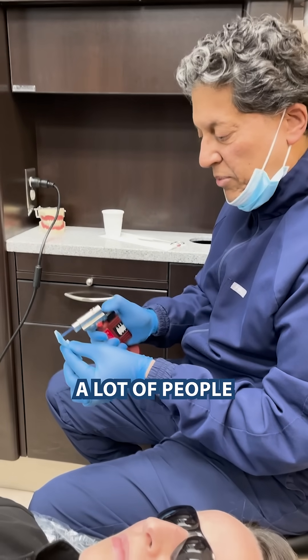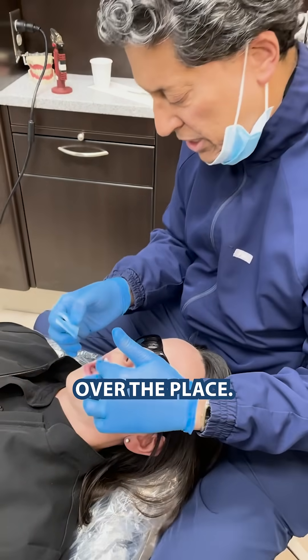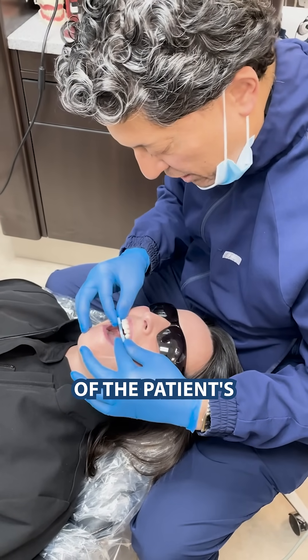I see a lot of people take bites and they end up being very large, with too much material and all over the place. So what I do when I take my bite record is I pre-cut it to the size of the patient's arch form.